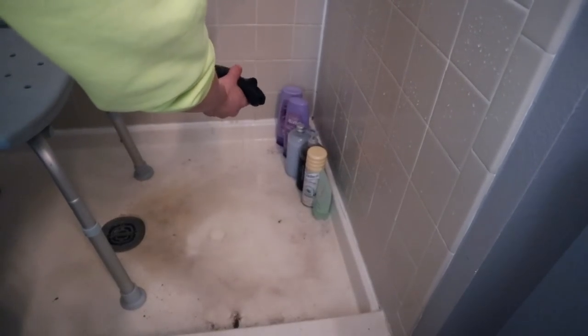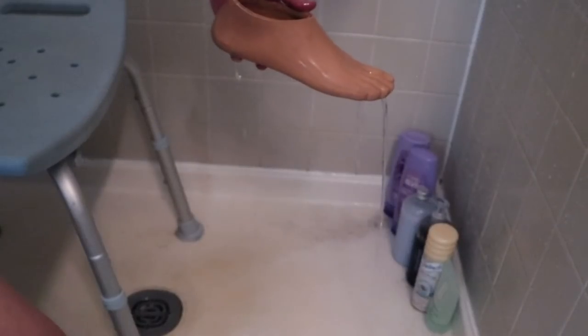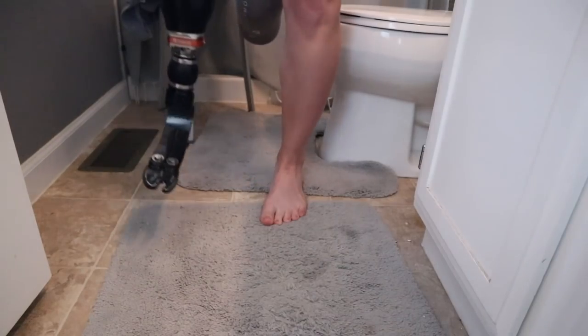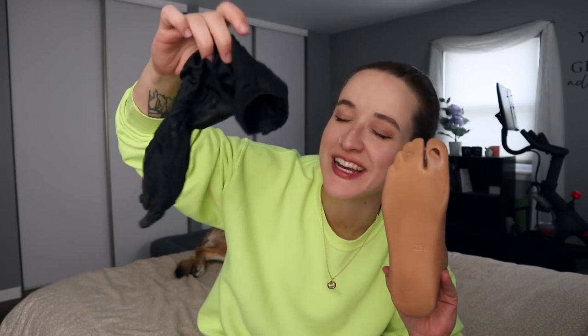I cannot look at this a second longer and I'm also ashamed to show it to my prosthetist in its disgusting state. So we're going to take just a moment to hopefully clean some of this out. Am I disappointed in myself? Yes. Am I a little bit ashamed? Also yes. Am I going to stop that from posting this on the internet for everyone to see? I'm not sure yet. This is so gross. I just need you to take a look at some of the water that is coming from this Kevlar sock — it is so dirty.